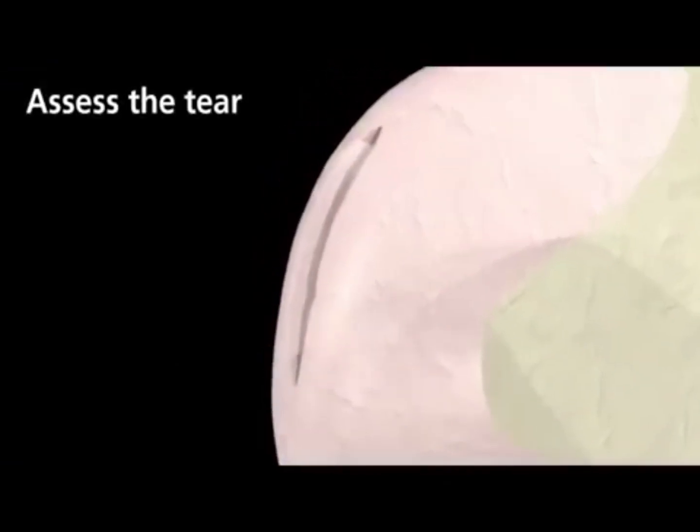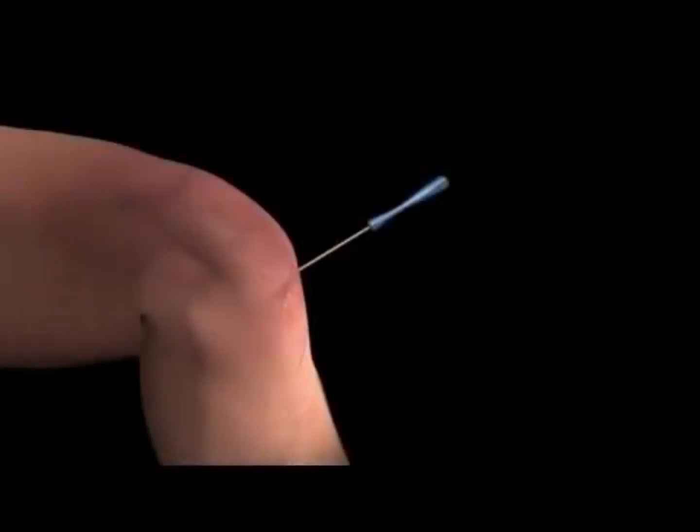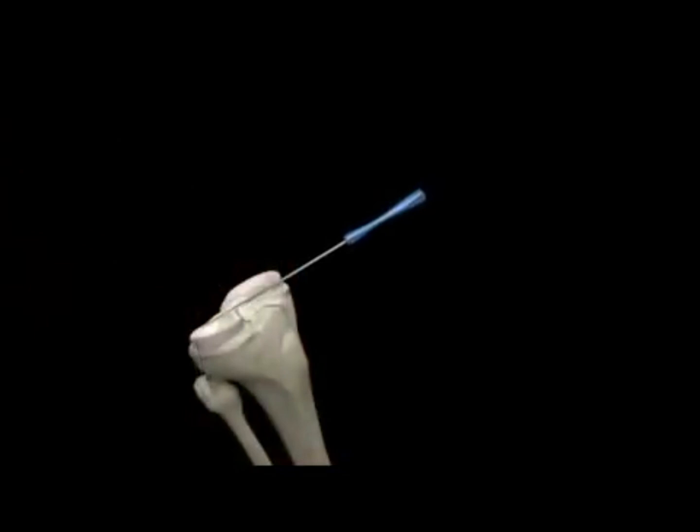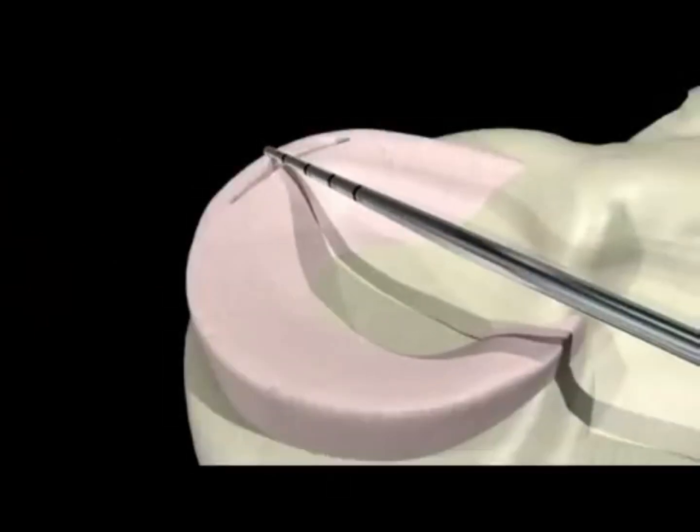Under arthroscopic visualization, the meniscal tear is probed to determine if it is suitable for repair. If repairable, the tear is prepared using the surgeon's preferred methods. Using the Covidien meniscal probe, approximate the distance from the capsular side of the meniscus to the desired needle penetration point at the repair site.